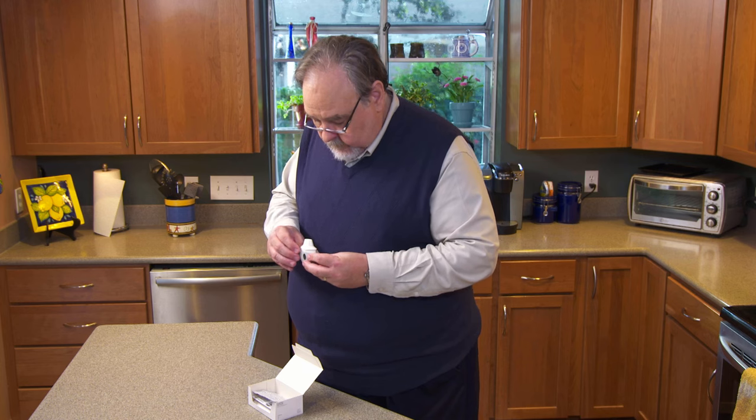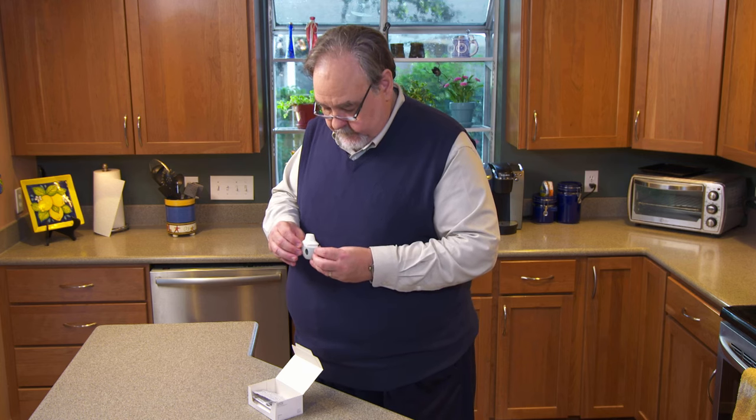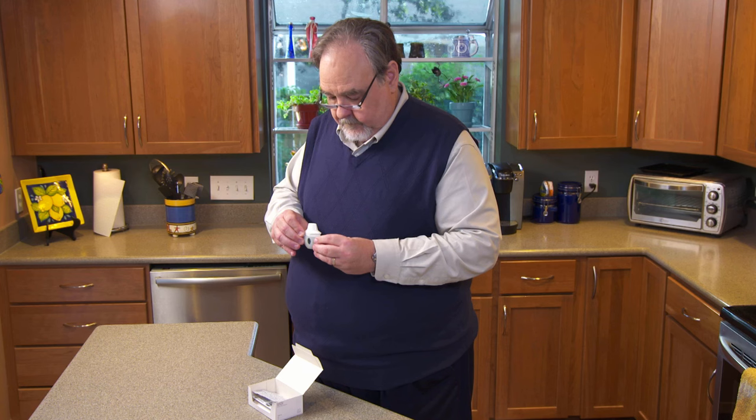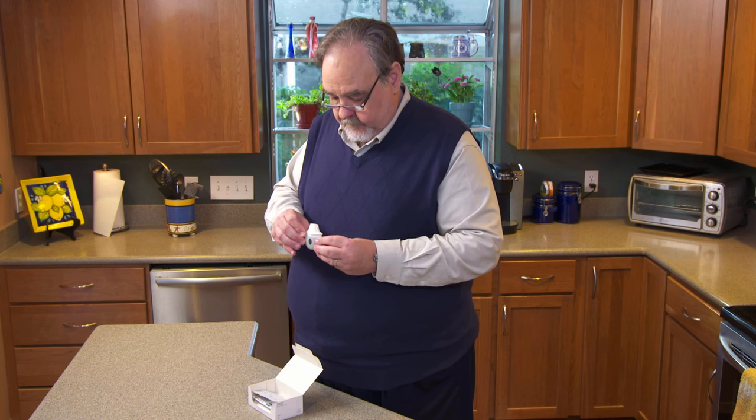Hold the HandiHaler device pointing up. Push the green piercing button again, then release it. This punches holes in the capsule so the medicine is ready to breathe in.